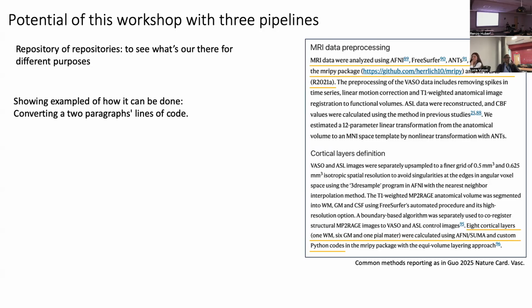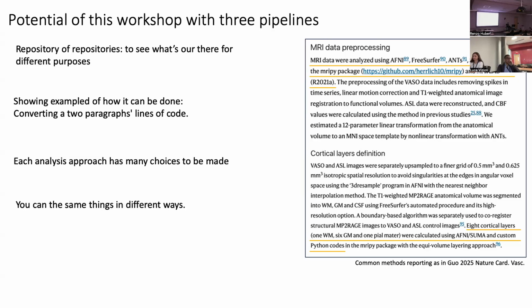Can I kind of reproduce what they did? Probably I can, because they publish all the code, and you can reverse engineer their hundreds and thousands of lines of scripts. But we want to give you an idea of something in between, that you can visualize in your mind: why do they use so many software packages, that it's usually a patchwork in layer-dependent fMRI, and that there are some basic steps you need to pay attention to. That's something we can bring across at this workshop.